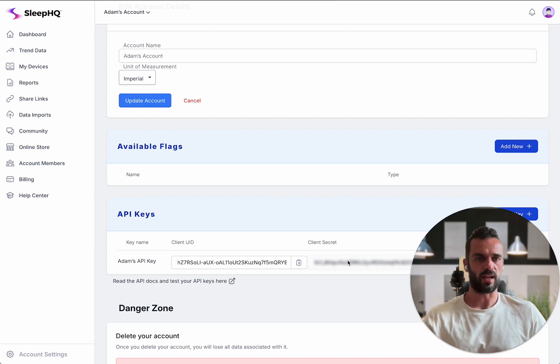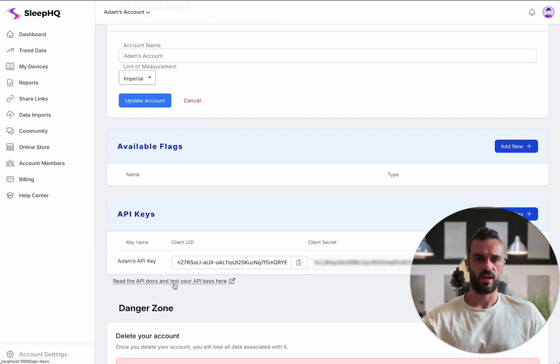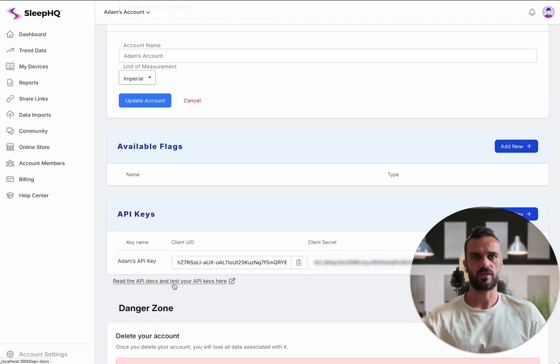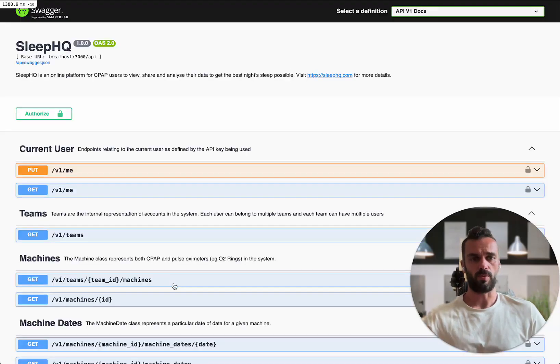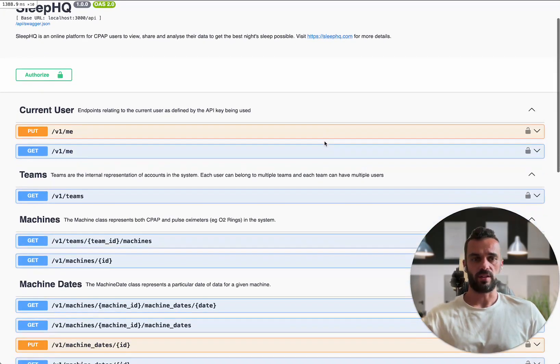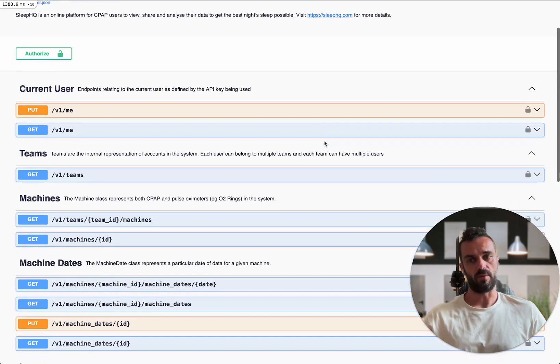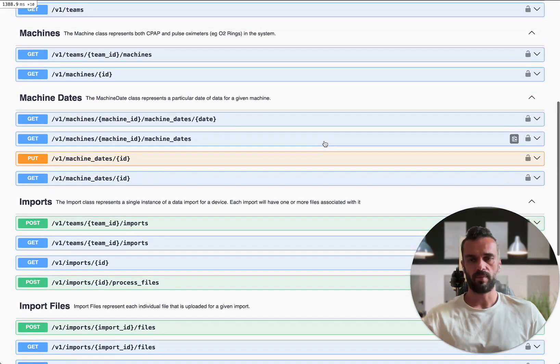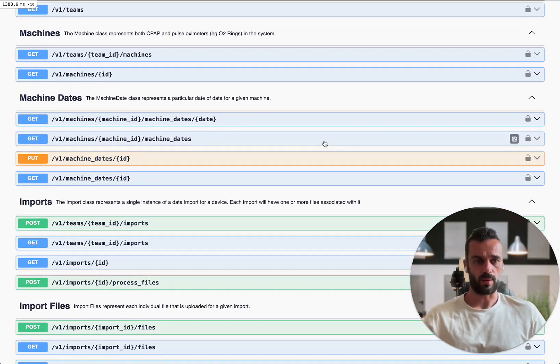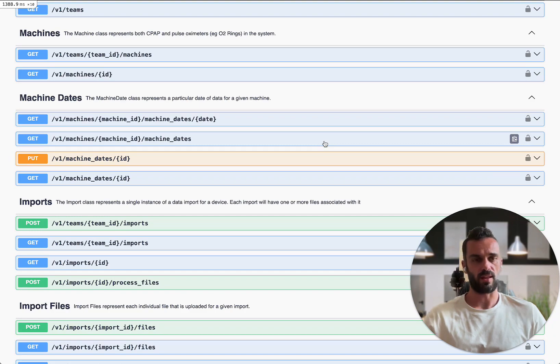It's giving me a client ID and a client secret. We've also got this link here to the docs. When I click that it's going to open up the API documentation. This is basically every endpoint that's available for the API along with the docs on what the parameters are for each of those endpoints and then what the return objects are going to be.